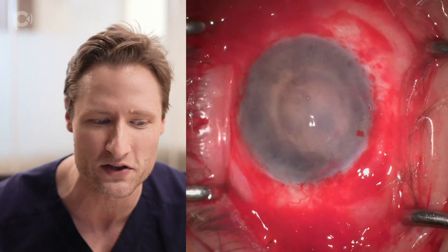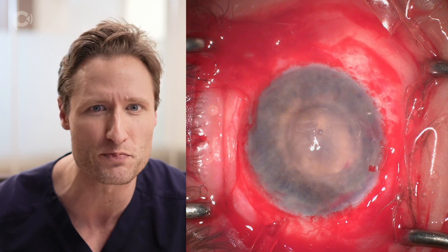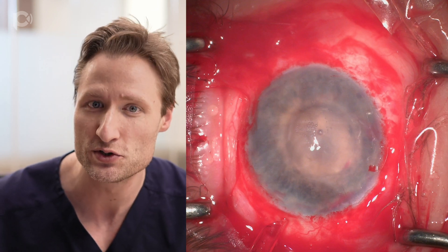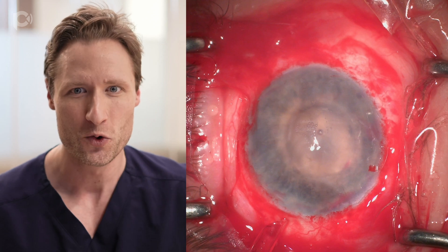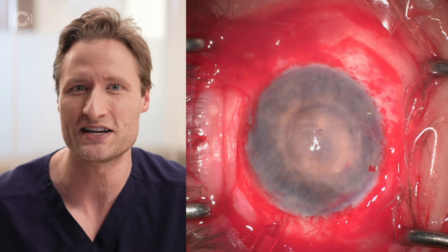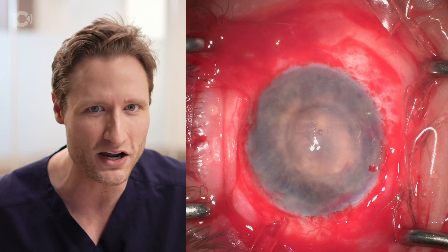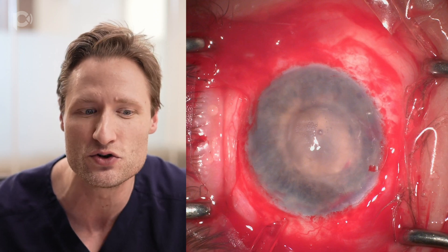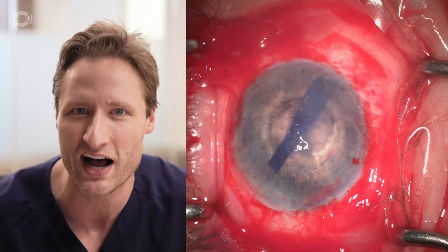We're getting ready to inject the graft. The pupil is mid-dilated and the iris is fibrotic and rigid — I don't think this pupil is amenable to suturing. We have a visiting observer, a brilliant cornea specialist from London, Dr. Hosni. Something he's really impressed upon me is that sometimes the best and safest way to do surgery is to do it quickly. Rather than mucking around in this eye trying to sew up the iris and fiddle with things, the best approach is to do it fast. We'll inject the graft into the eye, pointing the injector away from the pupil so we don't inject the graft behind the iris.